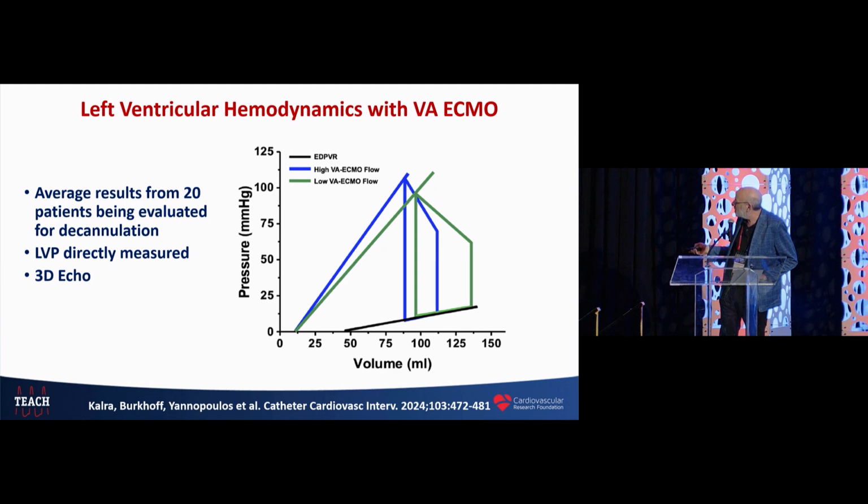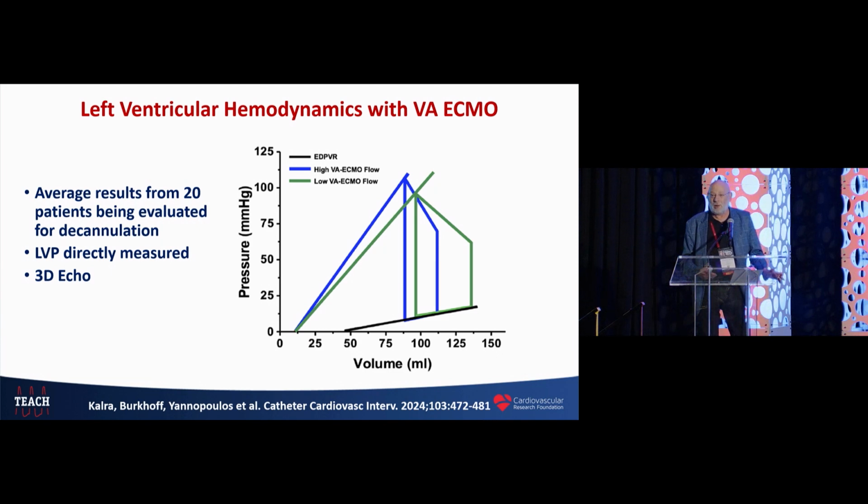In fact, these are results from a recent study from Dr. Yiannopoulos in Minneapolis, where he's showing that compared to low-flow ECMO, when you increase the flow, contrary to theory, in his patients the heart actually gets more unloaded, which is really the opposite of what theory would tell you. Theory tells you that when you increase the flow, the loading increases. So we don't know what is the deal here.